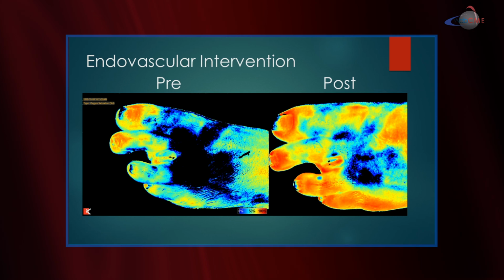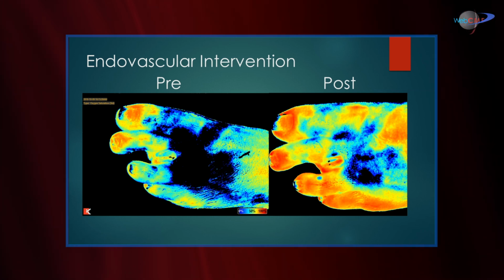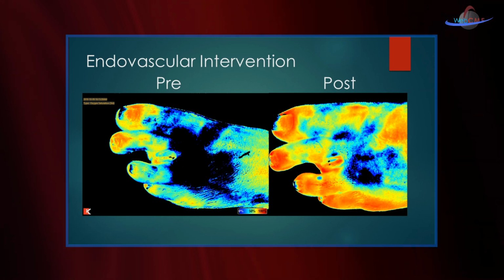And here you see a pre-endovascular intervention and then a 1 week post photograph. And John, I think, at least to my untrained eye, that looks quite a bit better, wouldn't you say? Yes, it does. So again, we're using this camera to follow and track the clinical outcomes.